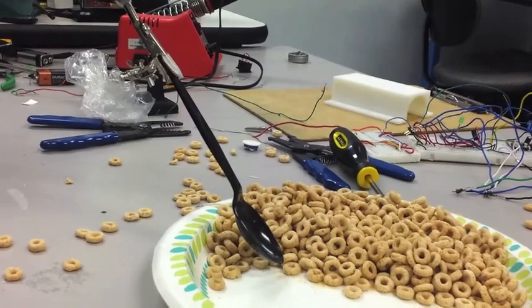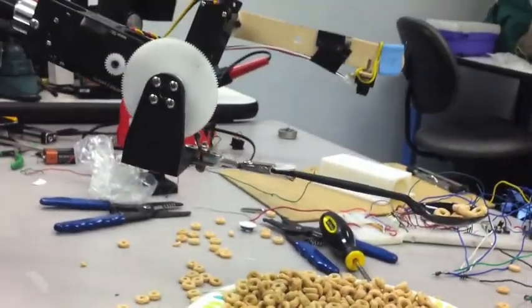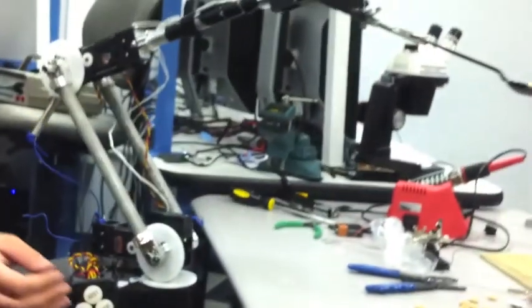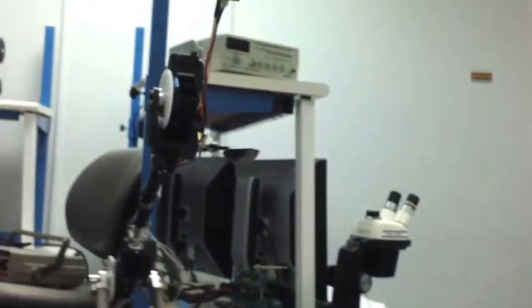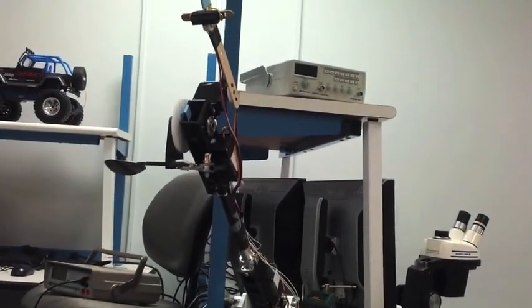It locates food, picks it up, and holds it in a level position until the user presses another command to send it to the mouth. It arises, maintaining stability and preventing spillage, then rotates to the user's mouth where it awaits until he removes the food at his own pace.